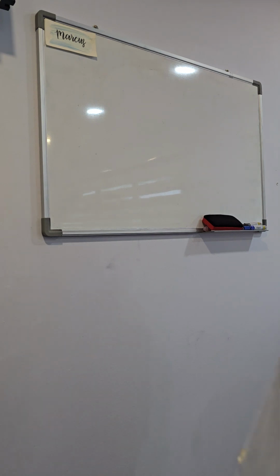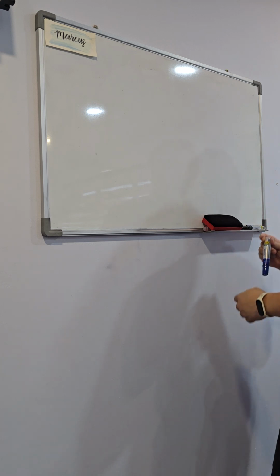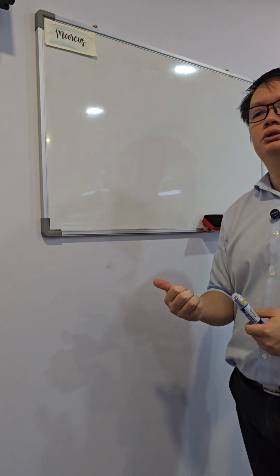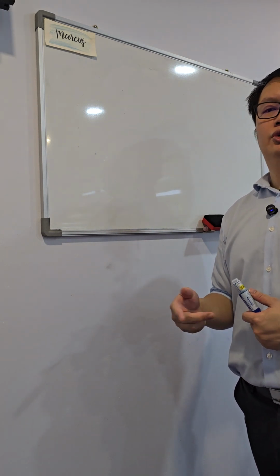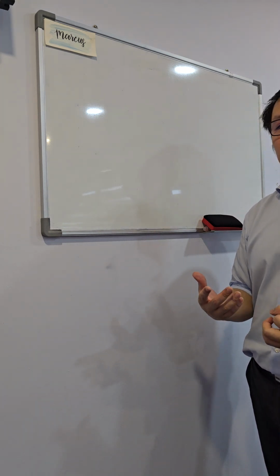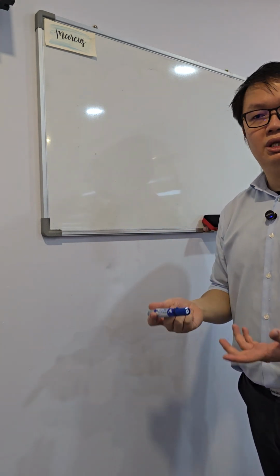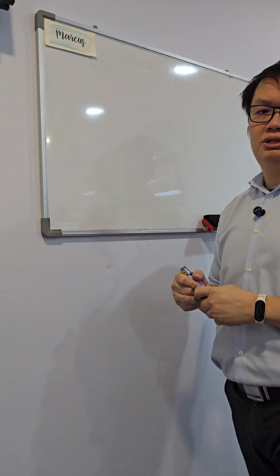Okay, so we're going to talk about electrical stimulations, and the few types of electrical stimulations that we tend to see are your TENS, your NMES, and probably your interferential, which is also similar to your radio frequency. The common thing is that they are all electrical stimulation. They use electricity, but the proposed mechanism is different.